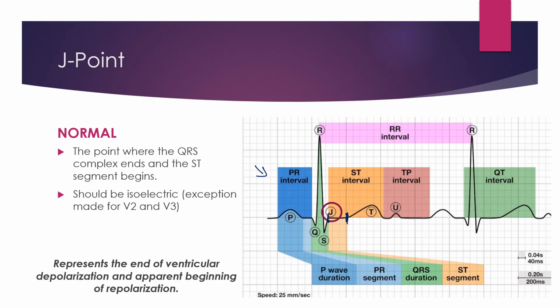Okay. So the ST segment is the area between the end of ventricular depolarization and the repolarization of the ventricles, which is the T wave. But in a lot of cases, the ST segment is not perfectly flat, okay? So in a lot of cases, you get something that looks more like this. And you would say that looks like the end of the QRS, and this is the T wave, and this is probably the ST segment, but it's not flat.